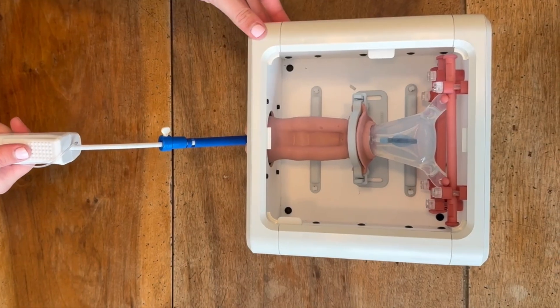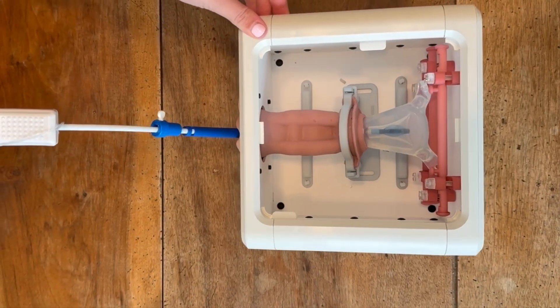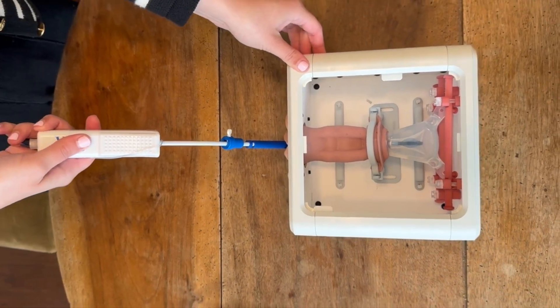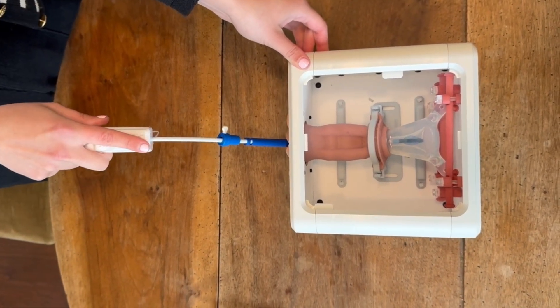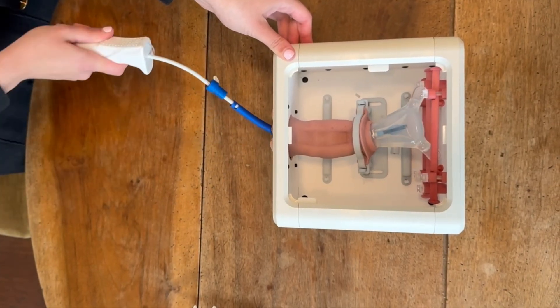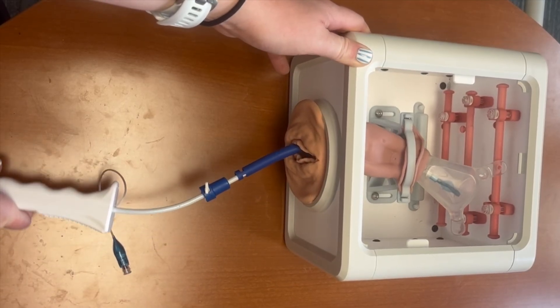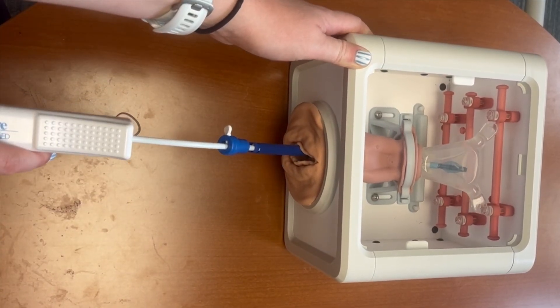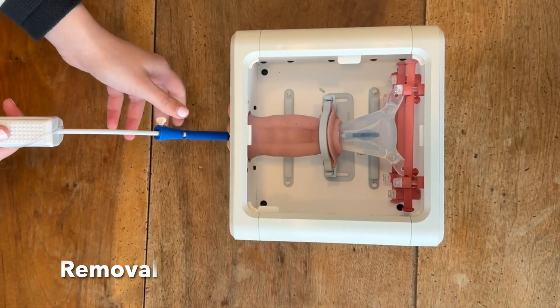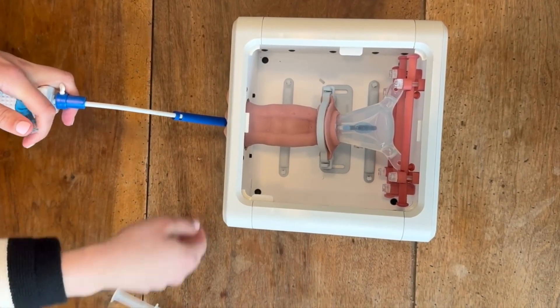Moving the device downwards moves the uterus anteriorly, and moving the device upwards moves the uterus posteriorly. Twisting clockwise rotates the uterus to the patient's left, while twisting counterclockwise rotates the uterus to the patient's right, although moving your hand to the opposite side may allow for further lateral displacement. To remove the V-Care, unlock the device, deflate the balloon, and draw back the entire device.